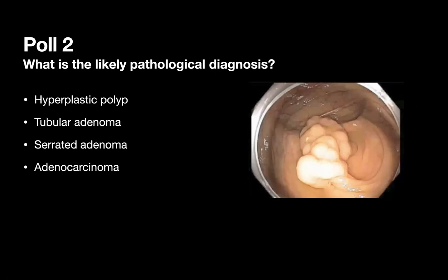there was a question in the chat. We had that excellent session with Roy and Sylvia and Tanya a few weeks ago about the NICE classification. So there was a question in the chat about if you have a picture of this with NBI, that would help us make that distinction a little bit better. Do you have a picture with NBI?